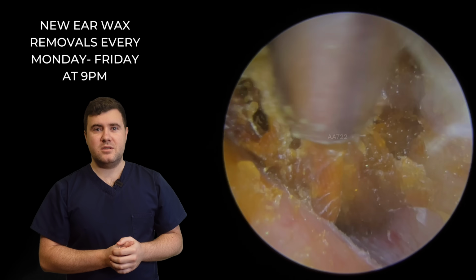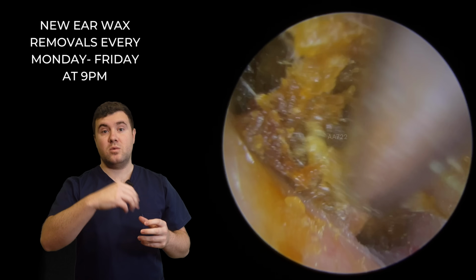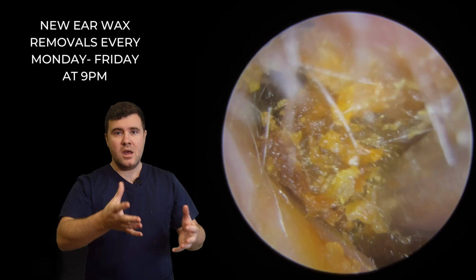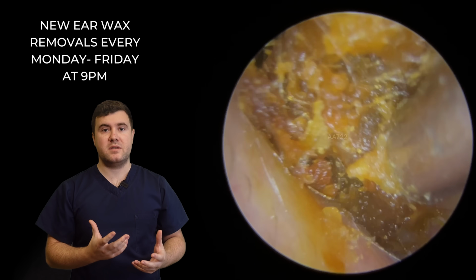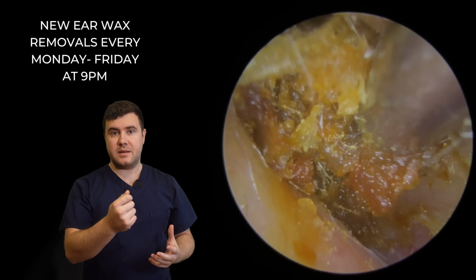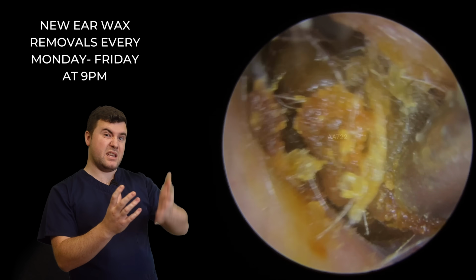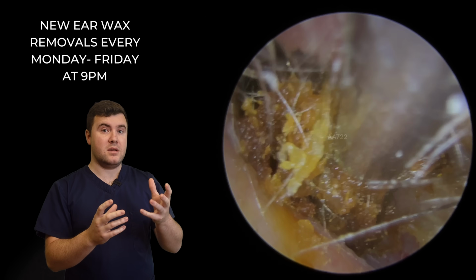Oh, there's a lot of hair matted in amongst this one as well, a lot of dead skin. So using a very similar technique to what I would personally use. So again, Rhys is going in from the bottom, trying to lift and peel this away off the ear canal. A lot of the time, as you're lifting this off the ear canal from the bottom, it tends to detach from the sides naturally, in most cases.